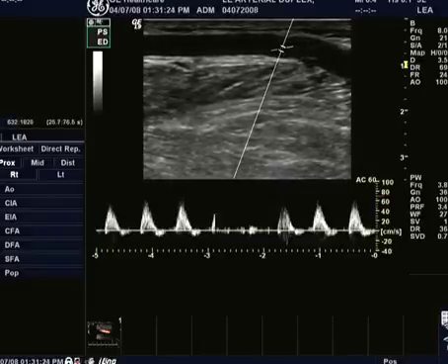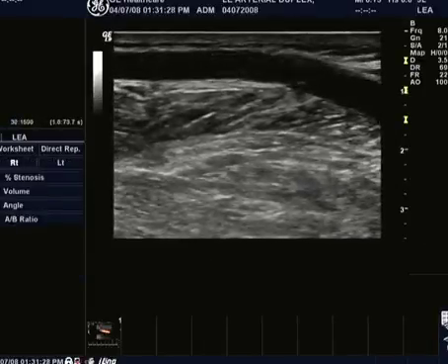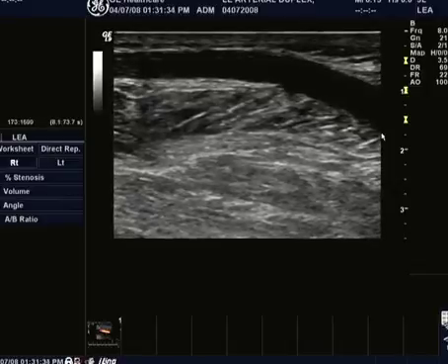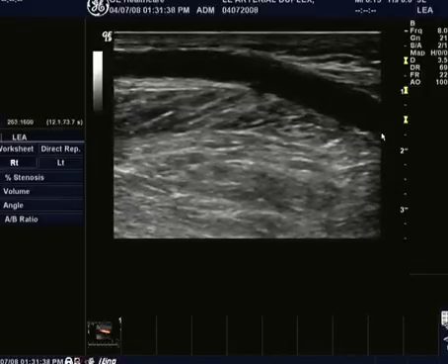And now we're getting down near the end here. Let me take the Doppler off. We can clearly see that the bypass is curving away. Here we are pretty flat and straight. Here it's starting to curve away. So we're coming down to the distal anastomosis at this point.